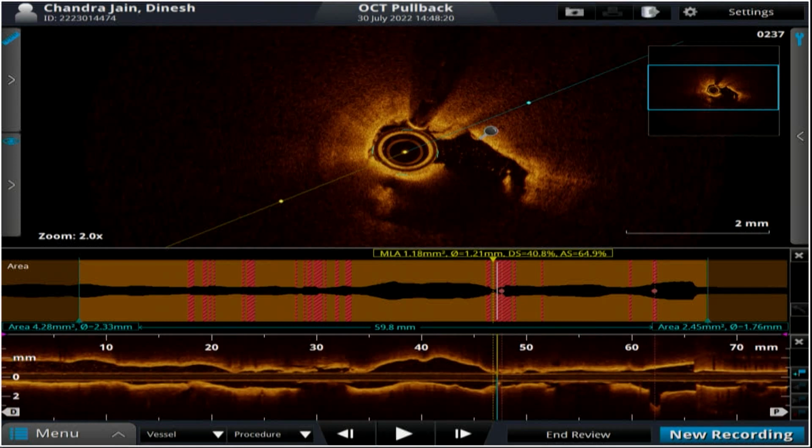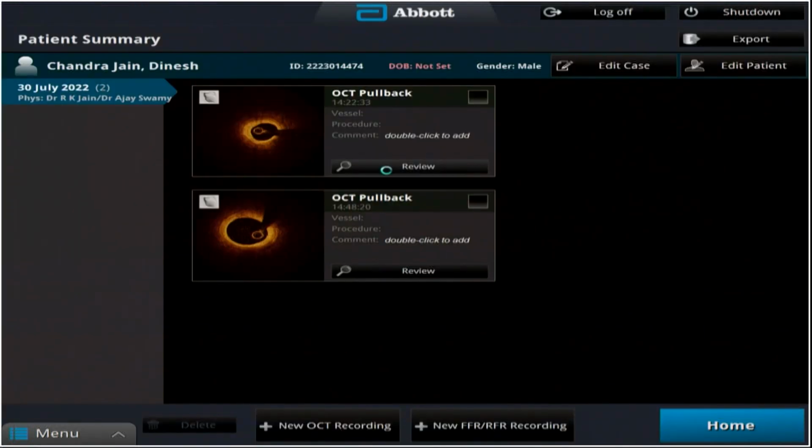So you start now with 2.75 distally, right? Yeah, we'll start distally first. So the plan is to take a short 2.75 by 23. And then do we need to overlap it with a 3.0 by 38 proximal? Let's work fast.